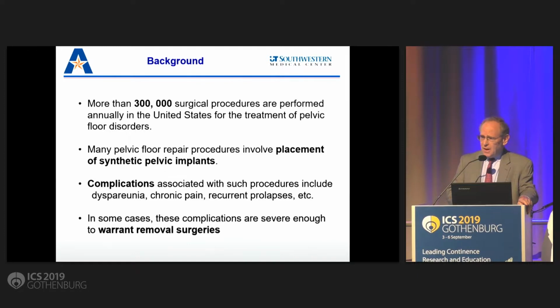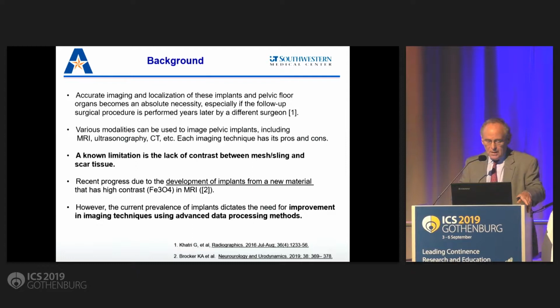So all of you know that we have lots of surgeries in the field, and many of them need mesh, and we see complications. And we are struggling to remove these, especially true in my place, a tertiary care center in Dallas. We have a lot of imaging technologies already available, but the problem is to define where the mesh is or where the sling is at times in scar tissues.